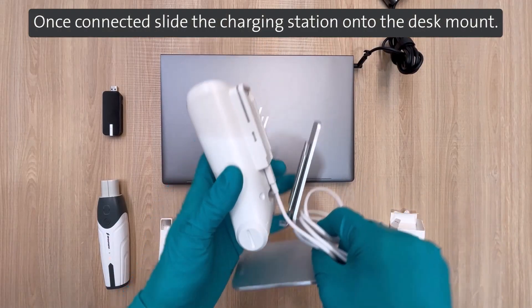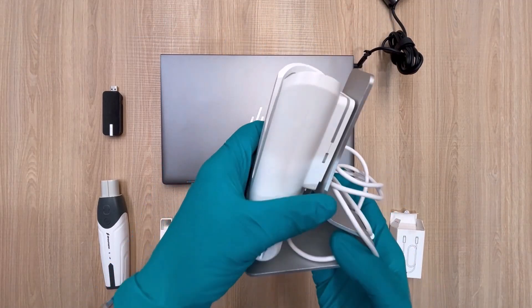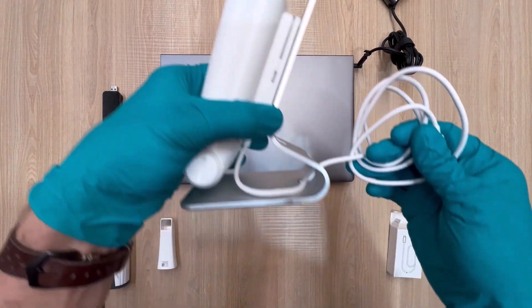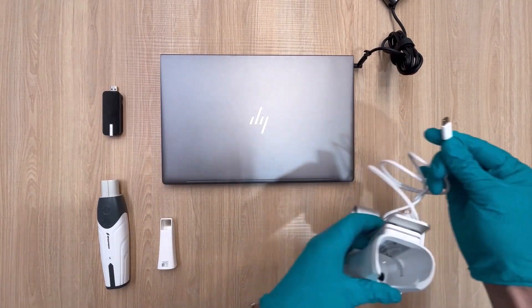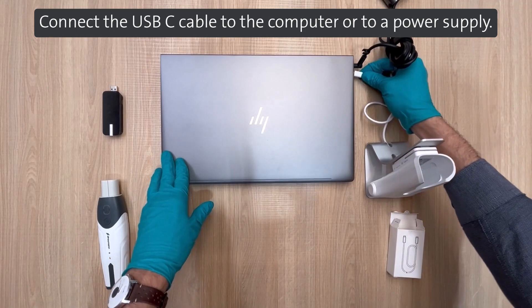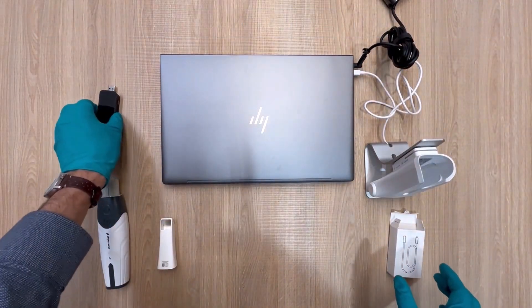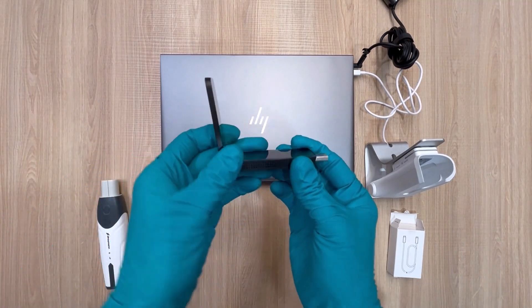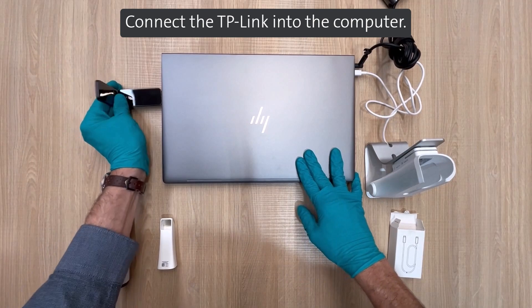Once connected, slide the charging station onto the desk mount. Connect the USB-C cable to the computer or to a power supply. Connect the TP-Link into the computer.